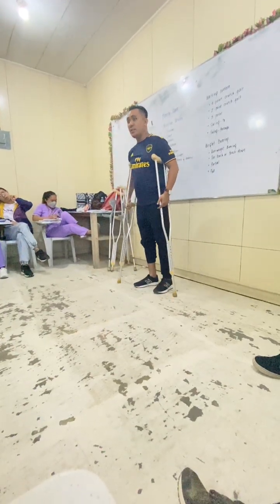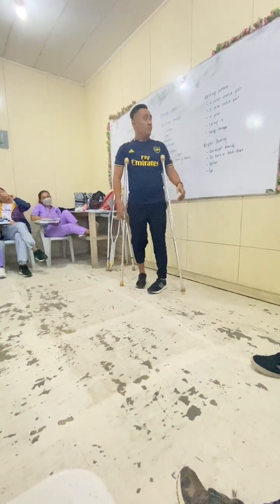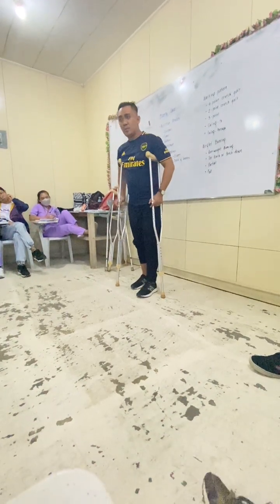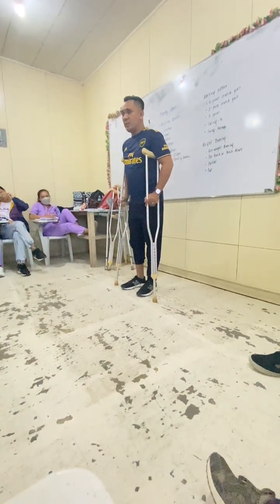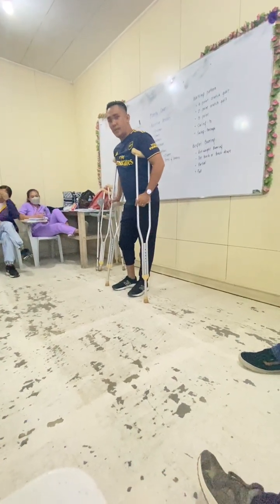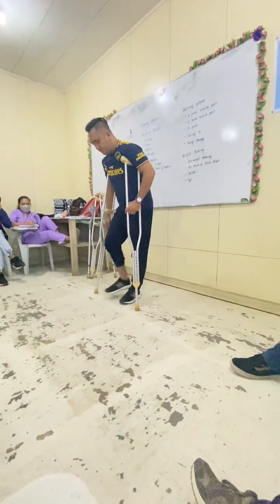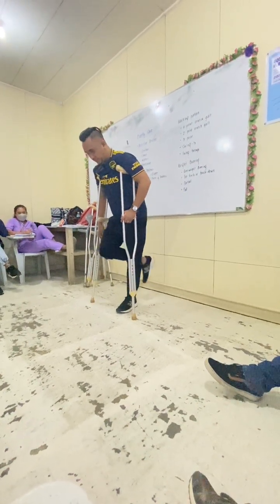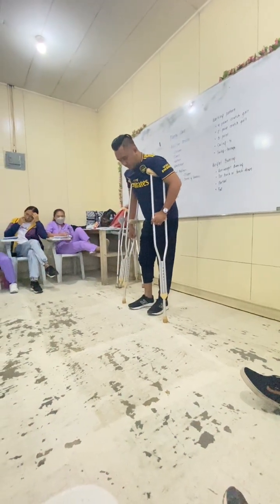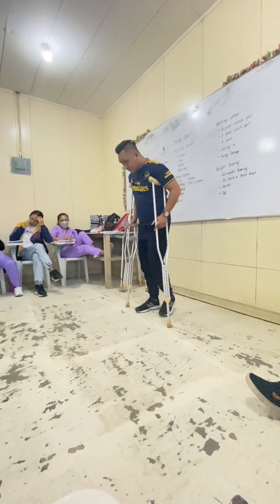Okay? But when the patient already is familiar walking using axillary crutch na siya, then they will move to 2-point crutch gait na ngayon. That's new. So the 2-point crutch gait is the same as 4-point, but duha ka moves ra. Can you read the procedures for 2-point crutch gait? Forward the left crutch and right foot together or injured affected leg and opposite crutch together. Forward the right crutch and left foot together or good unaffected leg and opposite crutch together.